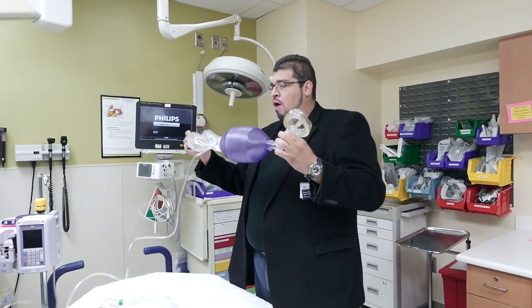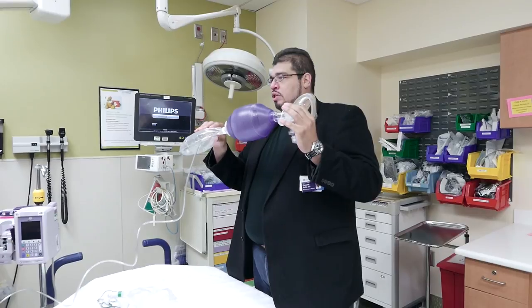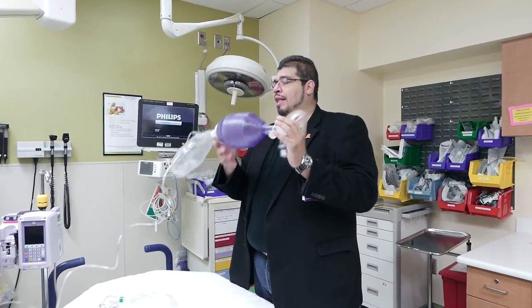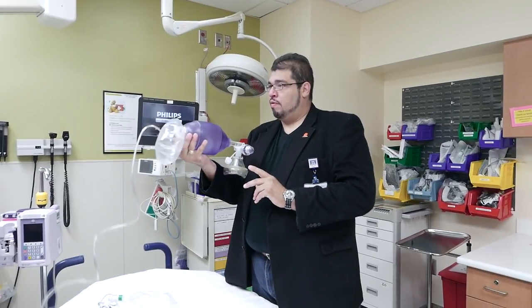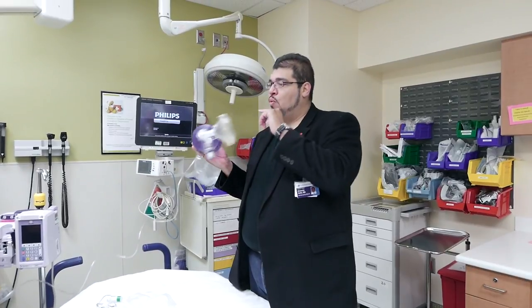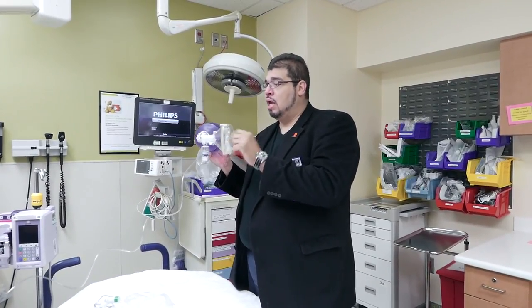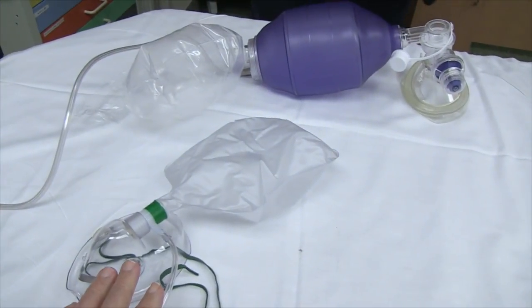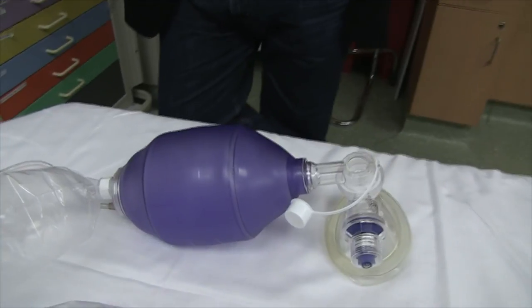You're just collapsing the bag. Now I'm not delivering 100% oxygen, because I'm delivering 15 liters per minute of pure oxygen, and that is mixed in with whatever room air goes into the bag. And when I'm exhaling, I'm also rebreathing CO2 into the mask. The CO2 will not go into the bag because there's a one-way valve. I think the literature does say there's a little bounce in CO2, but not anything significant. But the literature does seem to suggest that this is actually a better preoxygenation tool than this.